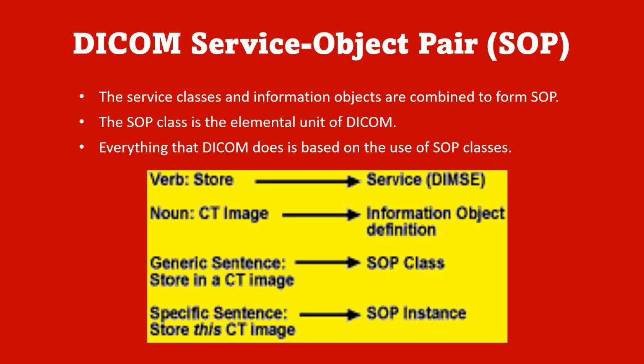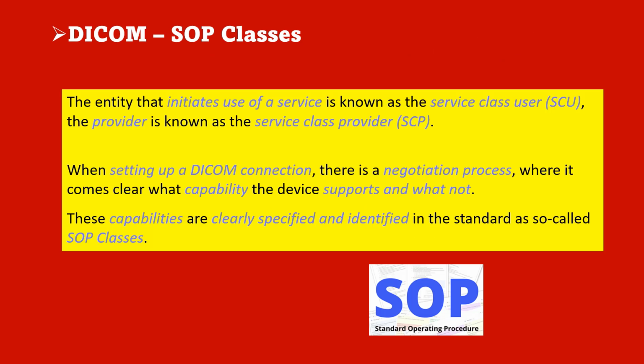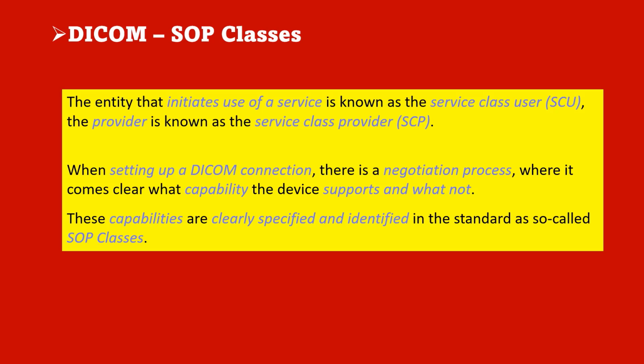The SOP class is the elemental unit of DICOM. Everything that DICOM does is based on the use of SOP classes. So let's take a look at DICOM SOP classes. The entity that initiates use of a service is known as a service class user, and the provider is known as a service class provider.